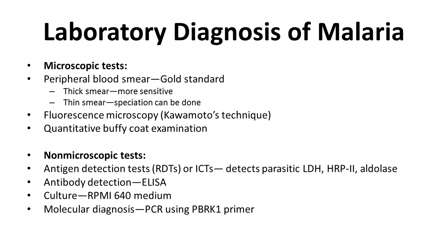So without removing the RBC, when we do the staining step, the RBC get stained, so we cannot identify the parasite. That means it is overlapping. The parasite and RBC also get the same color, so we cannot differentiate them. So before staining we have to remove the RBC, so we do dehemoglobinization using distilled water. That means removing the RBC.